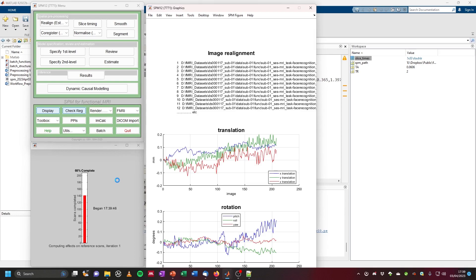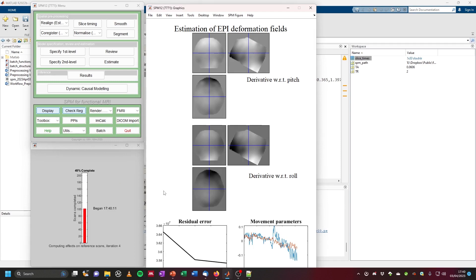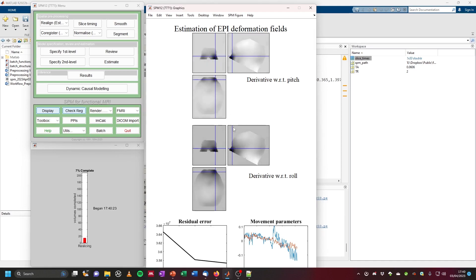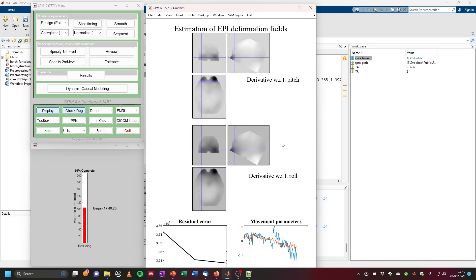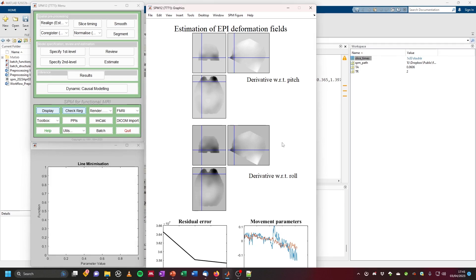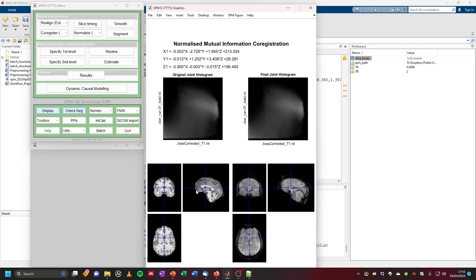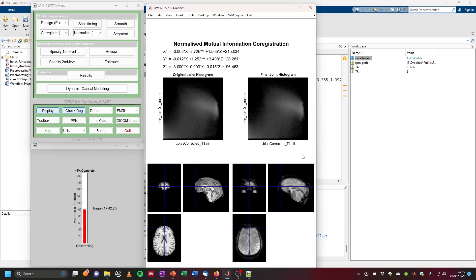These are the motion parameters we get from realignment. Then we get an estimation of the EPI deformation fields from the unwarp step — navigating through this, you can see the most deformation is in the orbital frontal part of the brain and very ventral temporal aspects, which is expected. Next, slice timing is performed, followed by co-registration — you can see how well the structural images on the left are aligned with the functional images on the right. Then normalization is applied, and finally smoothing.